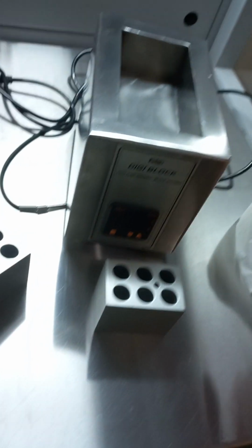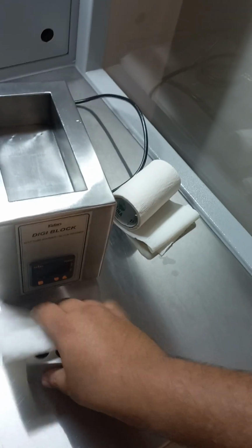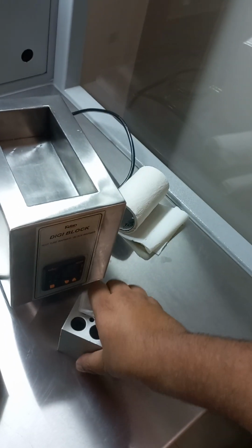This is also a good time to test and retest all your equipment to make sure that all your equipment is functional, so that if there is any issue with the equipment, you can replace it now and not tomorrow. So we have ensured that this entire surface is clean and sterile. For tomorrow's cases we have sterilized the individual blocks also. Some people prefer to do steam autoclave, that's also okay, but we have got very good results with the way we do our stuff. I am showing this to you with just one hand because the other hand is used to hold the cell phone. However, I am getting a decent cleaning done.